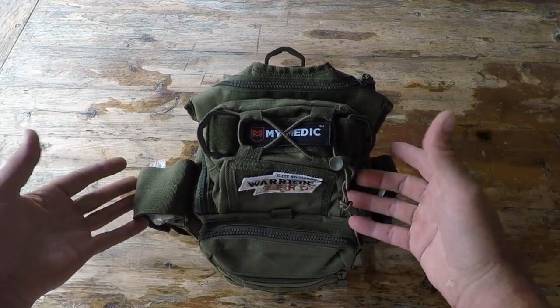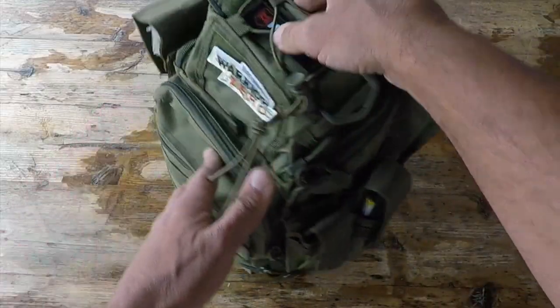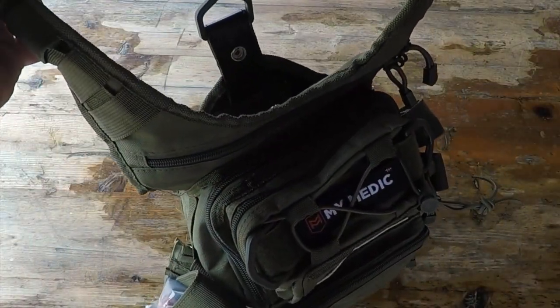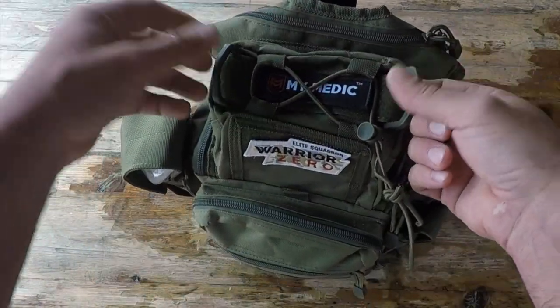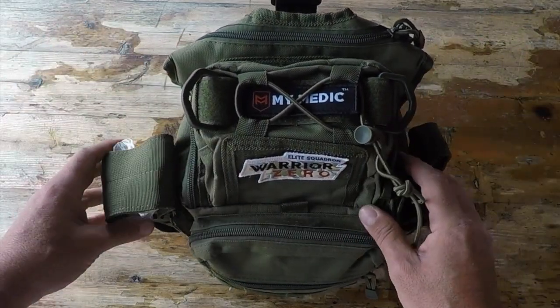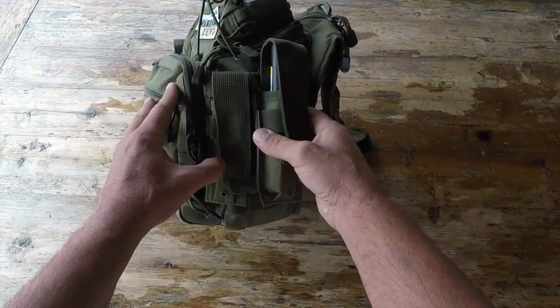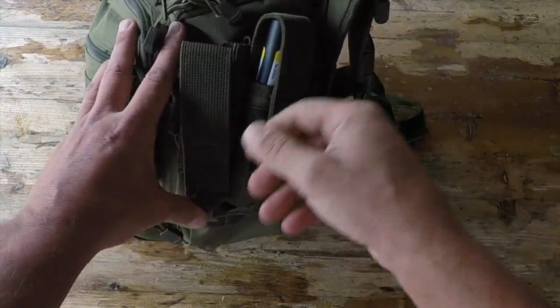Now speaking specifically about this Recon kit, it offers seven different compartments on this quality durable 600D bag. There are concealed pockets — so anything that you might want to have for your EDC. You have a nice shoulder strap here, and three different D-rings to be able to hang or hook up your pack, depending on the configuration that you're looking for. There are obviously panels here for various patches, and it comes with the MyMedic patch itself.